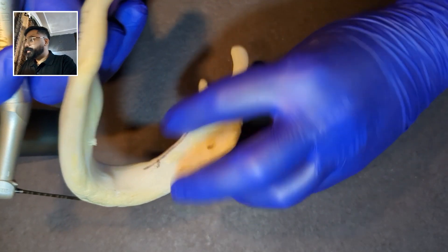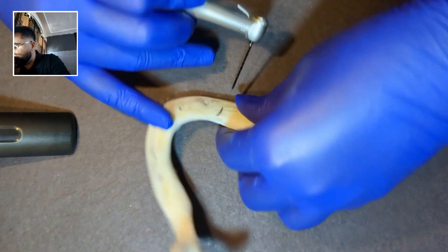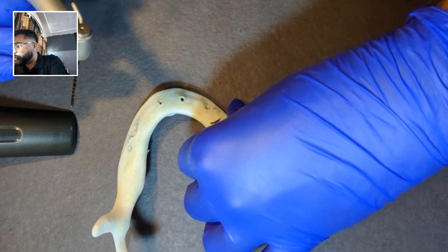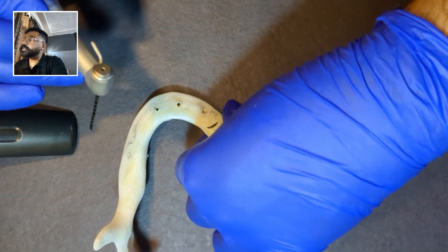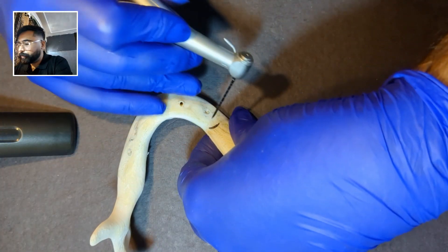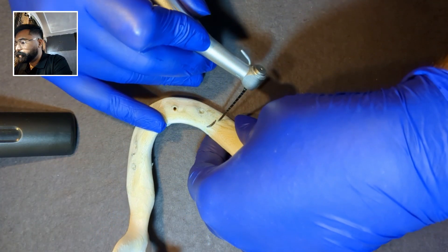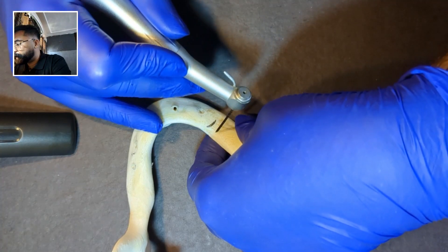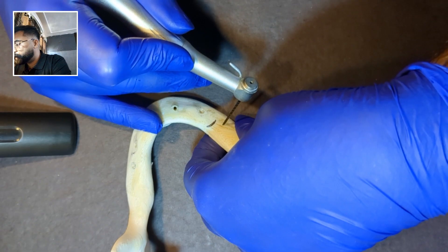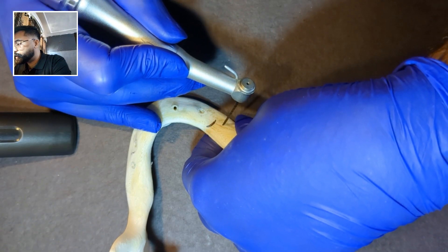So what we will be doing is: we start the osteotomy from the buccal side, first place the finger on the lingual side just below the mylohyoid, then place our drill buccally a few millimeters from the crest, and aim the tip of the drill towards our finger.